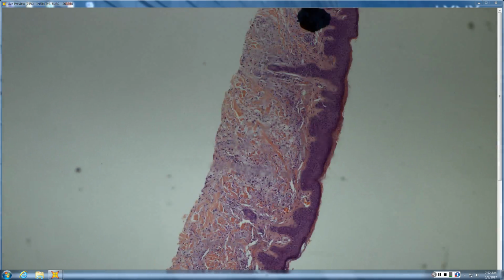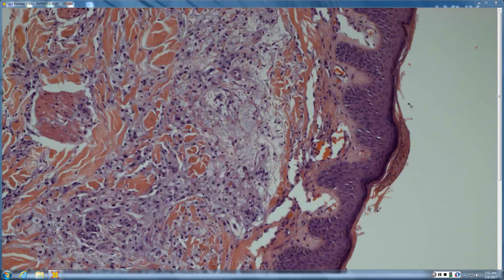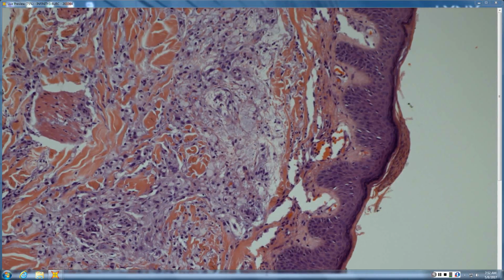Something that is appropriately fellow level here. Looks maybe xanthomatous with some histiocytes in there. So if it's xanthomatous and there are xanthoma cells, is everything within xanthoma, or what's this debris that's outside? It looks like there might be some extracellular as well. So you think of eruptive xanthoma? Well done.